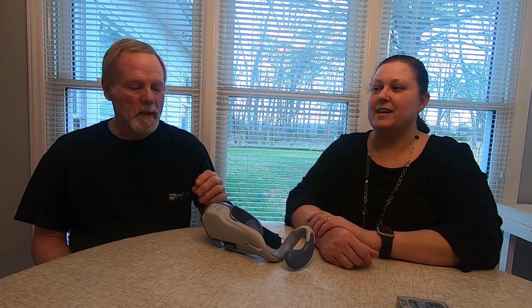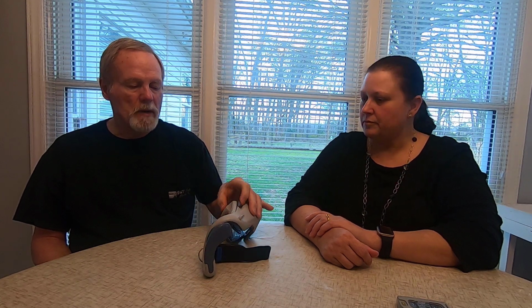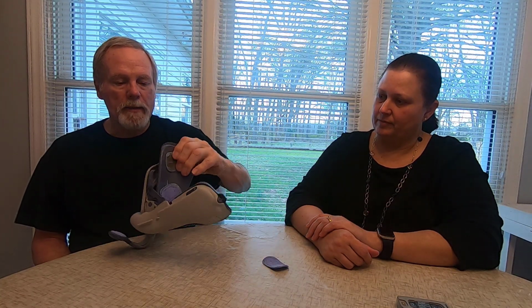Even the doctor that does his Botox injections in his hand said, you need to start using that device because your hand is definitely tighter than it used to be. Yeah. I'll show you. Open it like that, and these little pads come off, and you have to get them wet. I can take the little pads off, but I can't put them back on. So he needs help with that.